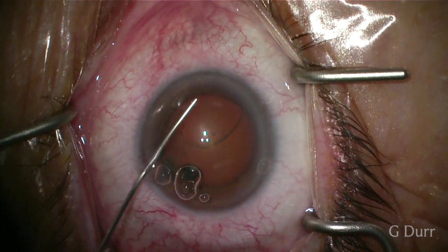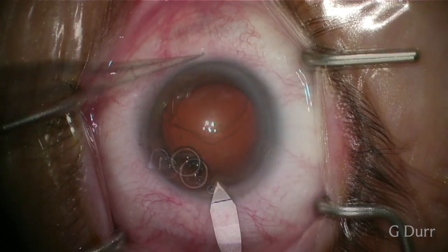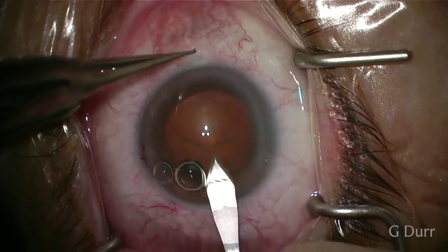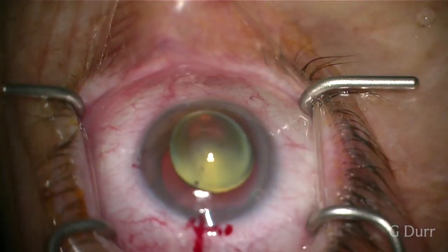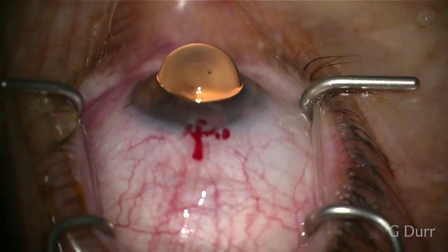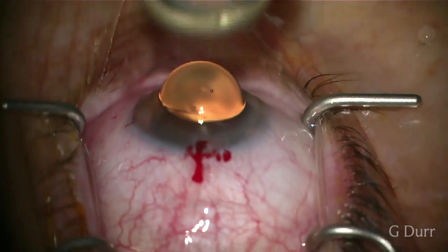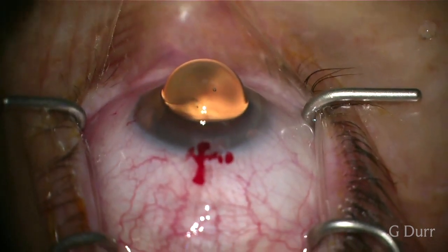We then create our main incision using a 2.2 millimeter keratome and then we tilt the microscope 30 to 40 degrees, turn the head of the patient away from the surgeon, and then we ask them to look straight ahead.